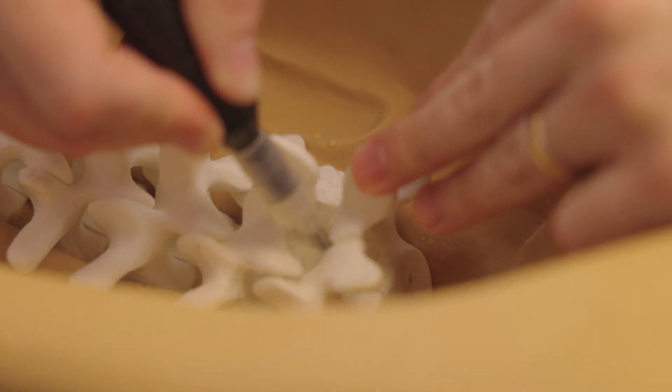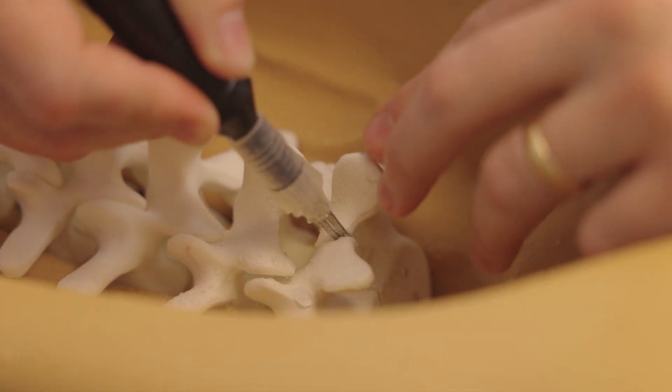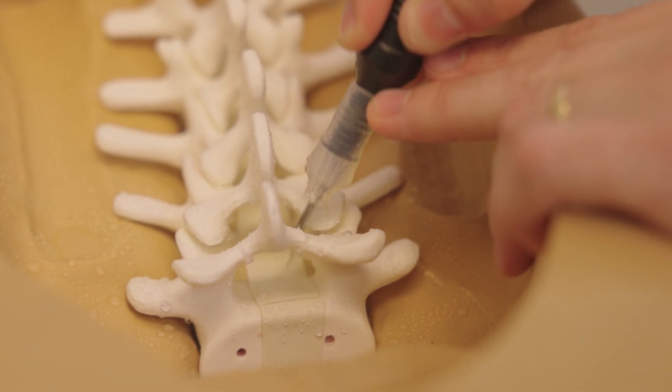Today, I'm excited to demonstrate the Misonics bone scalpel on a sawbone model to show how this technology works in clinical practice. By using this tool, I am able to make precise cuts while preserving healthy bone in the lumbar model through the outer and inner layers of bone, known as the lamina.